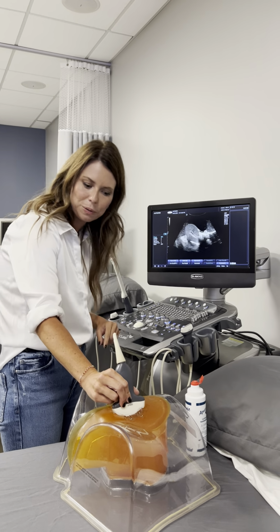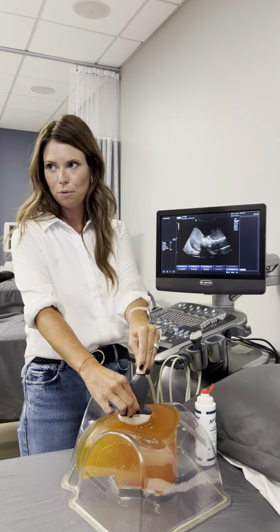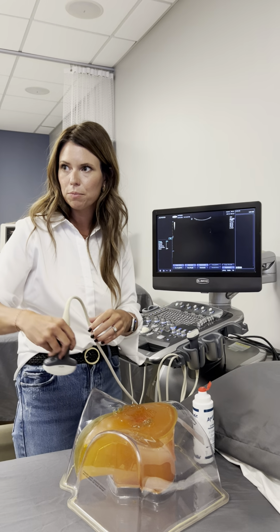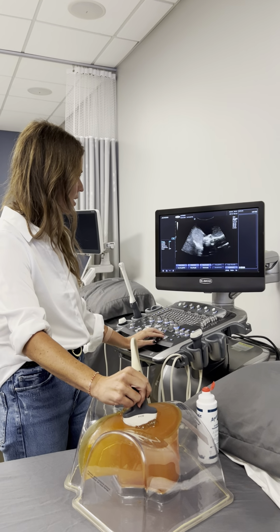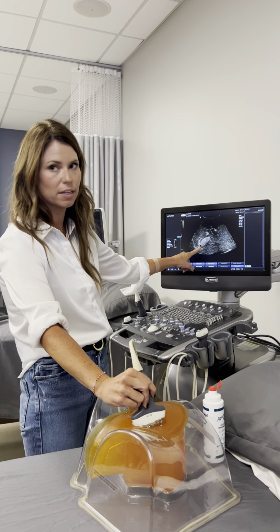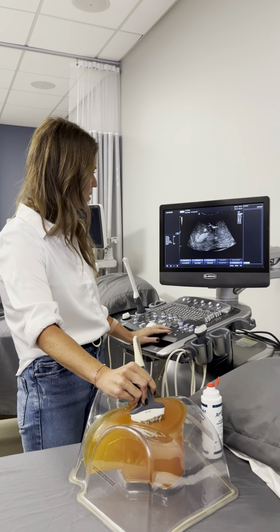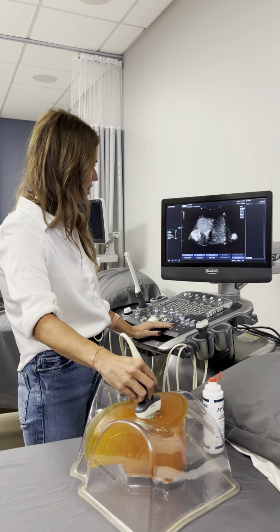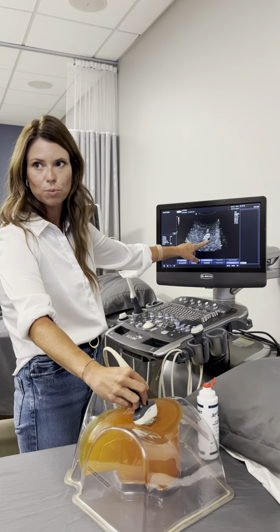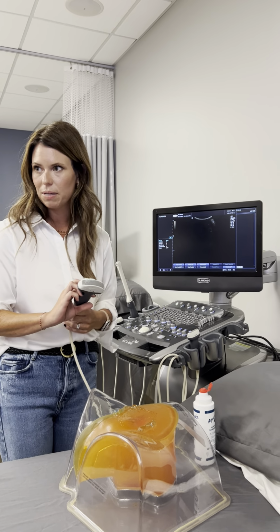I'm just pulling it to the left like this. It's really little movements. We're not looking at a liver or gallbladder where you're moving around a lot. You're moving just slightly because these are little organs. This is only probably 3 centimeters, a little bit over an inch. So I'll look at this ovary and then go transverse on it to get its width and do vascular flow, and that's basically it for that.